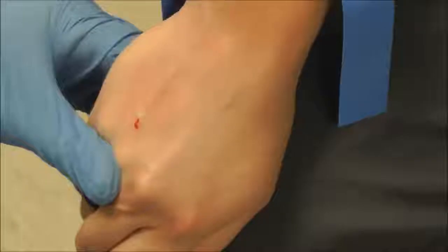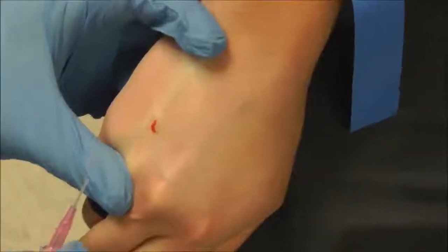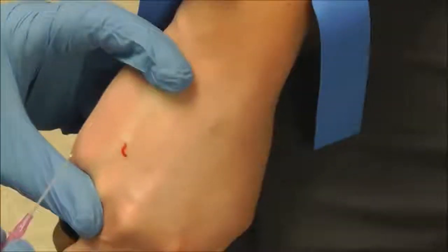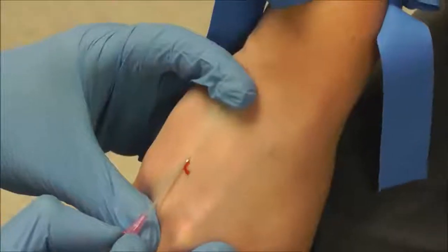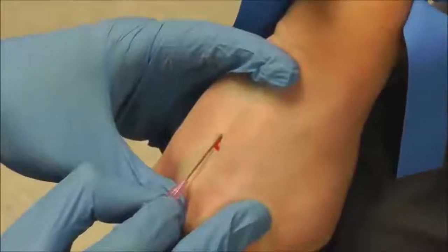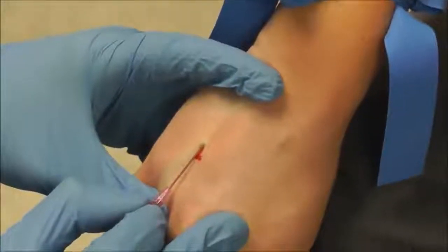I'm going to hold traction in that direction — it gets my thumb out of the way — and I'm going to hold counter-traction in that direction. I see where my vein is. Next thing I'm going to do is go in 100% parallel. I'm going to go in here until I get a flash. Here's my flash of blood. I'm going to advance this just a little bit.